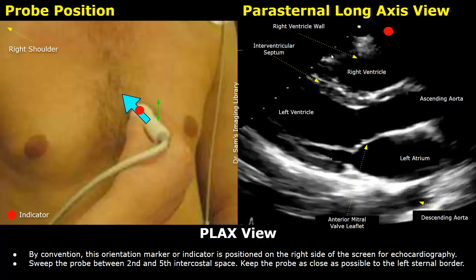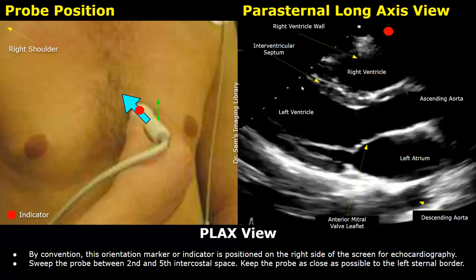This is the parasternal long axis view of the heart. Starting from the top of the image, this anechoic chamber is the right ventricle — the anterior-most chamber, which is why we see it first. After the right ventricle, we find a thick echogenic wall: the interventricular septum, present between the right and left ventricle. Behind the septum is a larger anechoic chamber — the left ventricle, which is larger than the right ventricle.